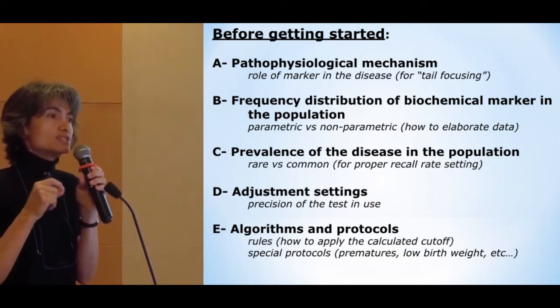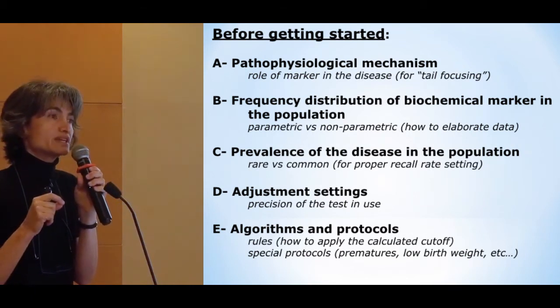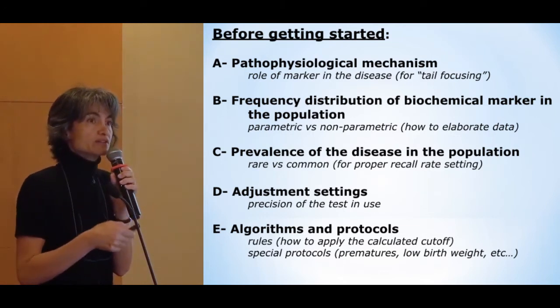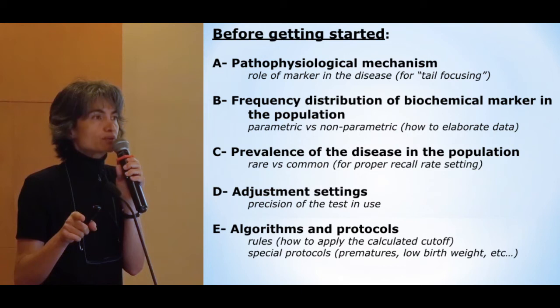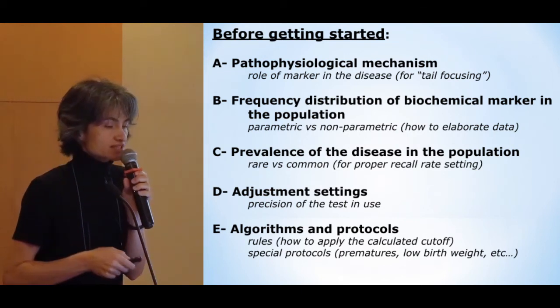Whereas the G6PD will be a hallmark for enzymatic deficiency in the lower range. So you have to be well aware of this, because you have to focus your attention on the range of values which are hallmark for the disease.